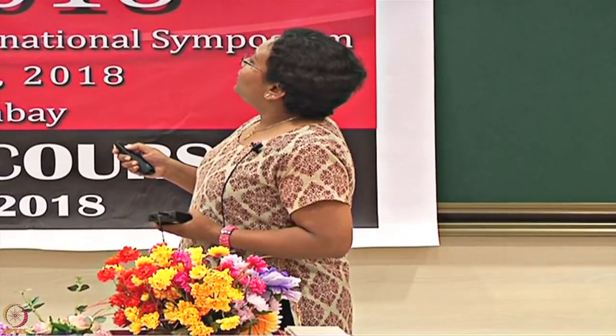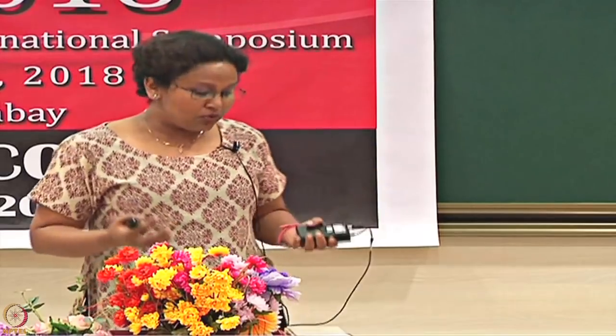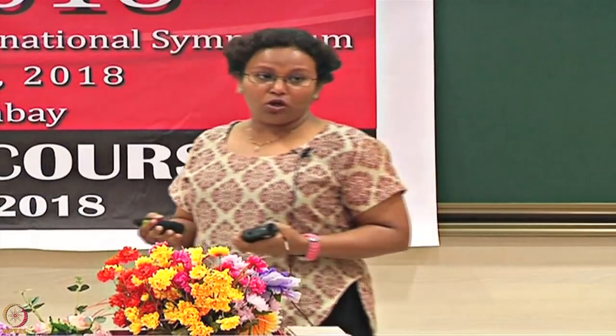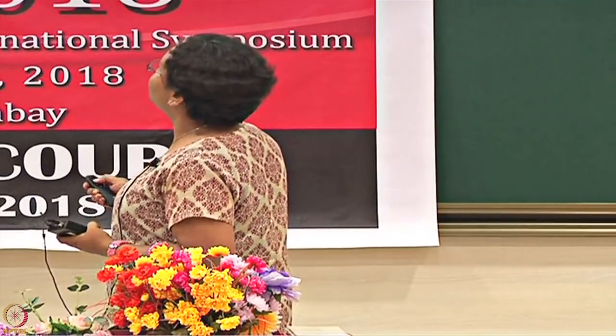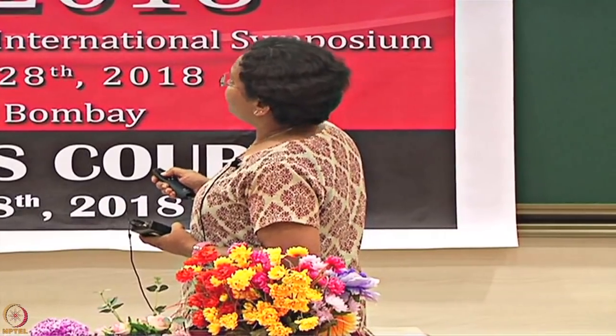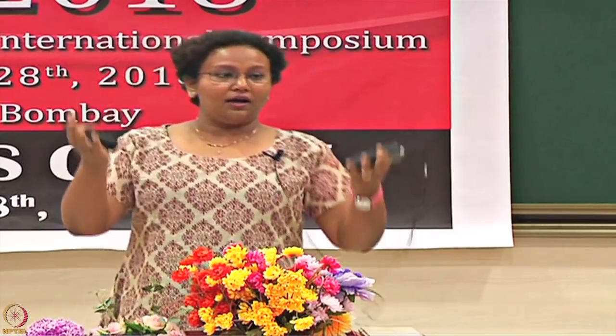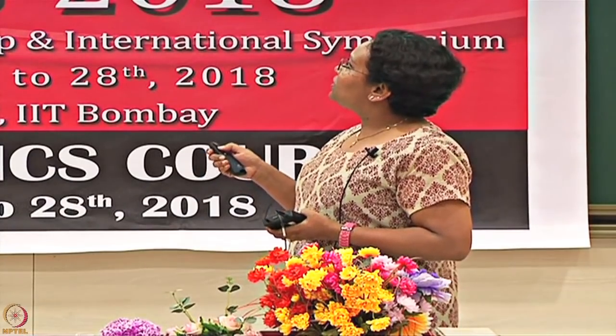Now, this is where we call it surface competition. The competition is happening at the surface. You have the analyte, and you attach or link your analyte with a competing analyte, in the sense it's a high molecular weight analog. The key is the high molecular weight analog. When you attach it, the size of this should be considerably larger than your analyte.